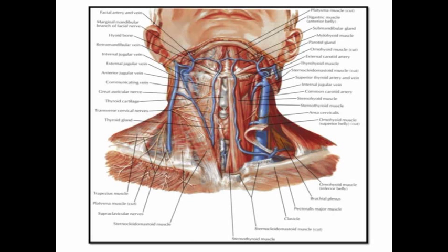And so just as a reminder, despite the fact that you have images on your ultrasound screen, it's really important to remember that you also have to orient yourself anatomically. I can think of two cases in the past couple of weeks in which there were IJ lines placed overnight, and I think the residents lost sight of the fact that you should be at the top of the triangle made between the sternocleidomastoid heads and the clavicle, and ended up having two supraclavicular IJ lines, one of which caused a pneumo.